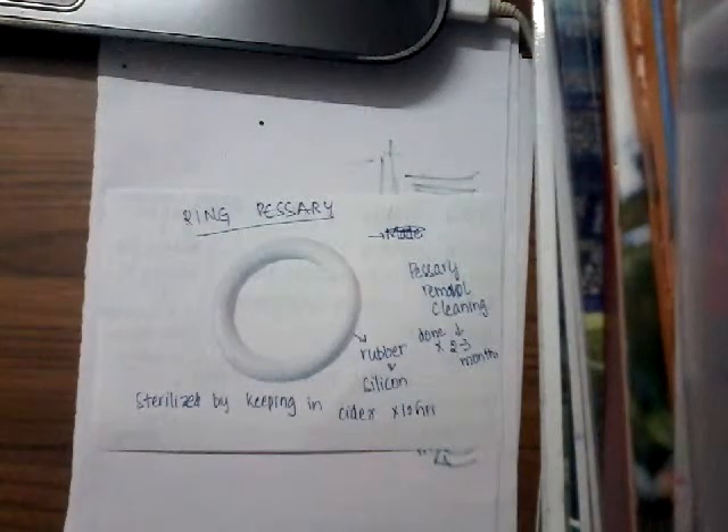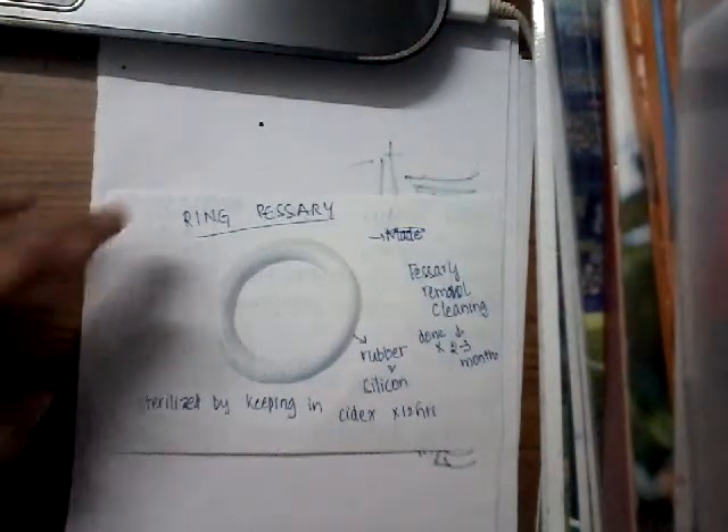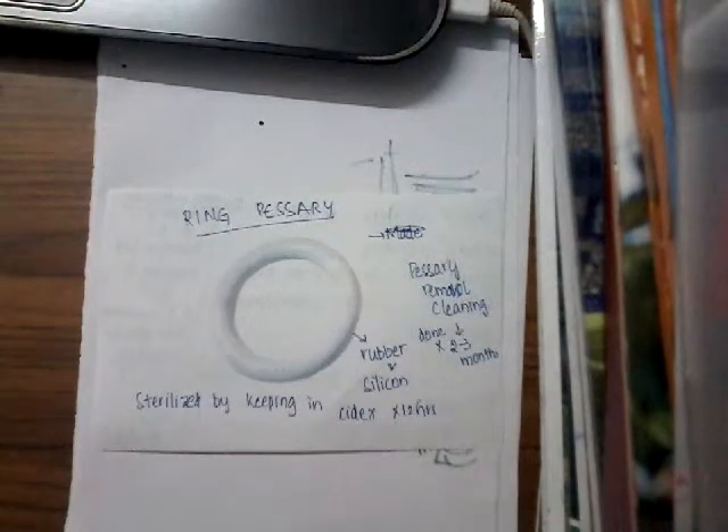Hello friends, welcome to a new lecture. I would like to discuss about the ring pessary. So this is the ring pessary. If you see, it is a round instrument and it is made up of either rubber or silicone.